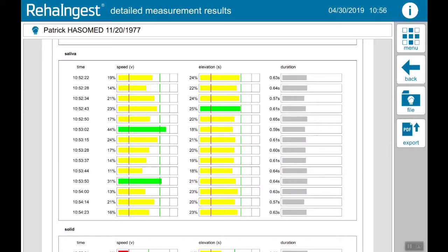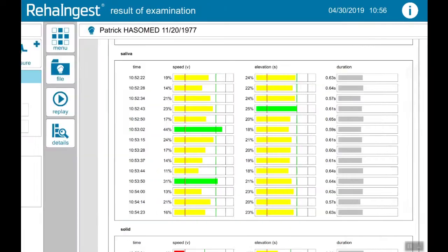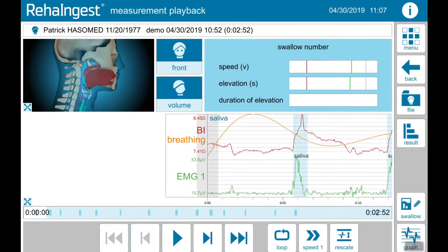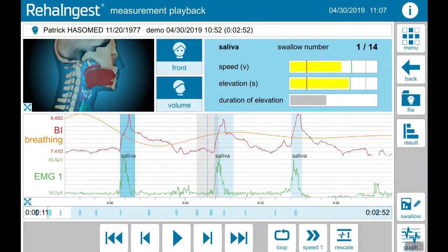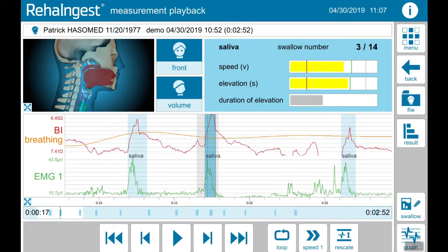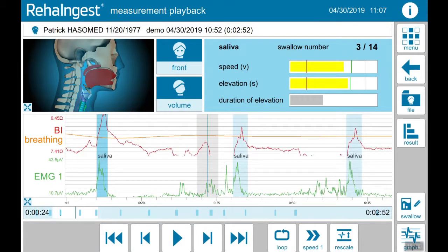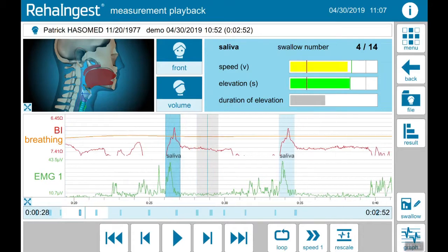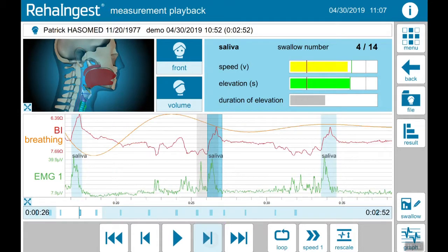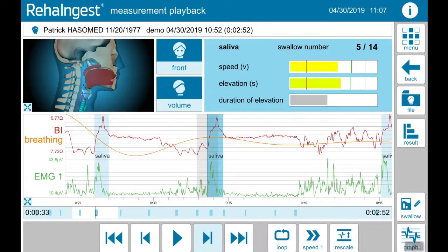Now go back to the overview and tap on replay. Here you can see the recorded measurement. Move through the timeline either by grabbing the curves and moving to the left or to the right, or use the arrows on the bottom to jump from swallow to swallow.